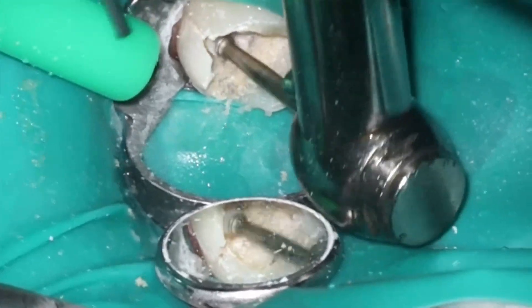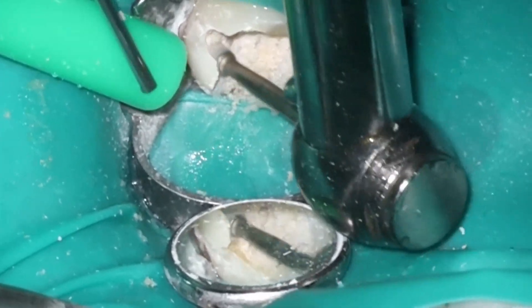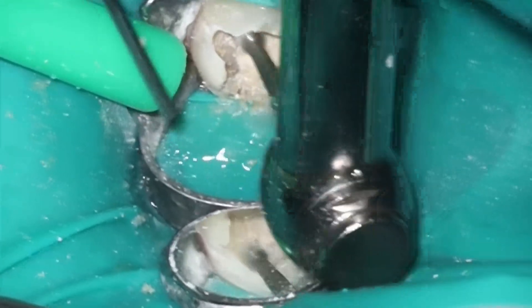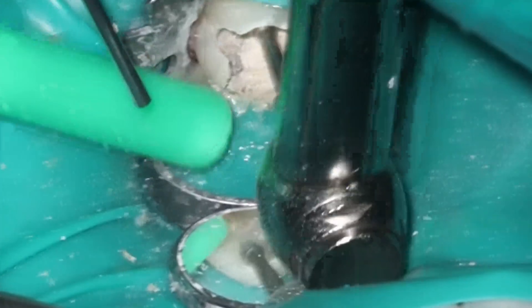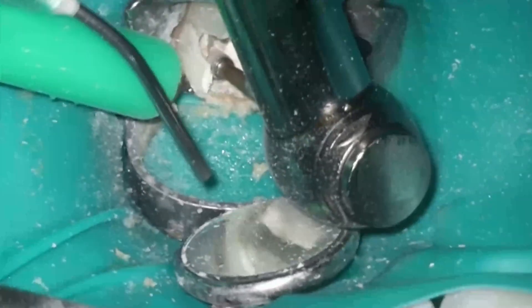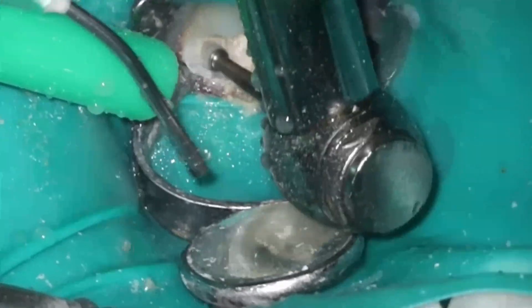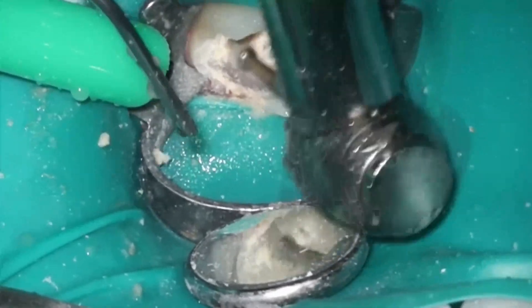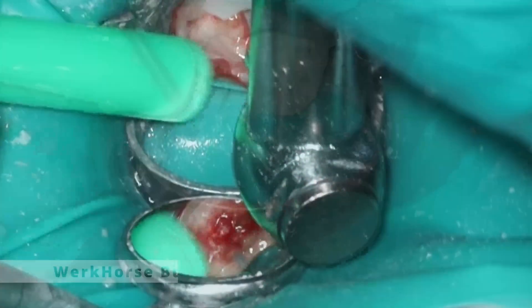Another tip whenever you're dealing with these younger patient cases: oftentimes they are going to have a buccal pit, which was one of the entry points where that carious lesion came in. So very good idea to remove that as well. You can see how I brushed up against that and how this tooth is just a shell — that's all that is really left. This is your classic case: lots of Mountain Dew plus lots of fluoride makes the enamel really hard, and the dentin on the inside is a little soft.